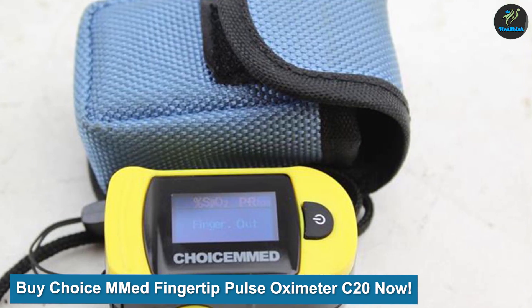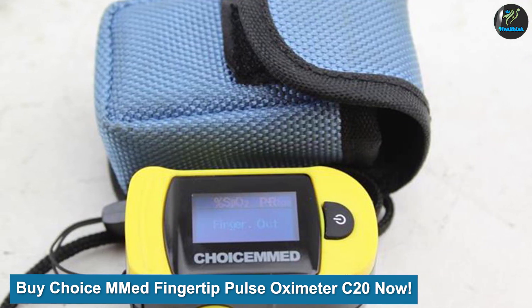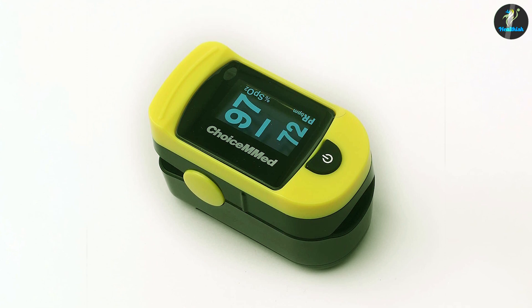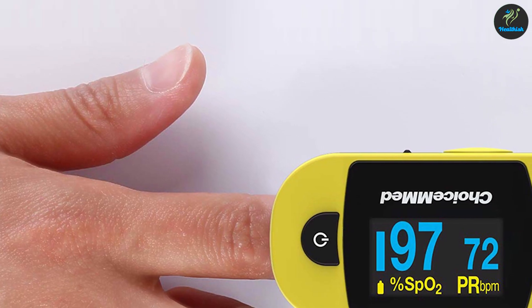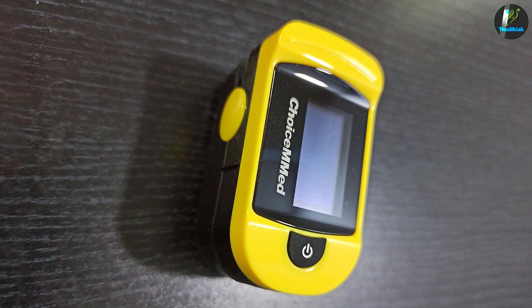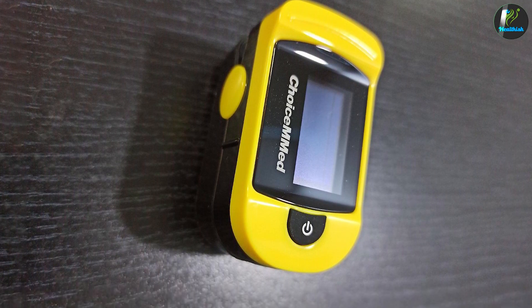Buy the Choice M Med fingertip pulse oximeter now. No one wants to experience an emergency, but if you do, it's best to be prepared. One way to be prepared is by having this oximeter on hand. It is easy to use and can help you monitor your blood oxygen levels and pulse rate. You can buy the Choice M Med fingertip pulse oximeter C20 now at Halo Healthcare.